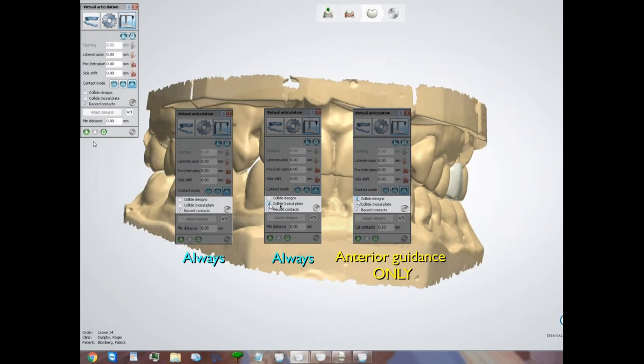These three selections — record contacts, collide incisal plate, and collide designs — were also a bit confusing. We always want to record contacts and always want to collide incisal plate, which means tooth guidances are in effect — it respects where the teeth are in the stone casts as if we were working the models together. Collide designs is intended only for cases of anterior guidance, where we want our designed tooth to be respected in guiding the mandibular arch, allowing the cuspid lingual to lift off the mandible during lateral and protrusive movements so we can design the incline to disclude the posterior teeth.